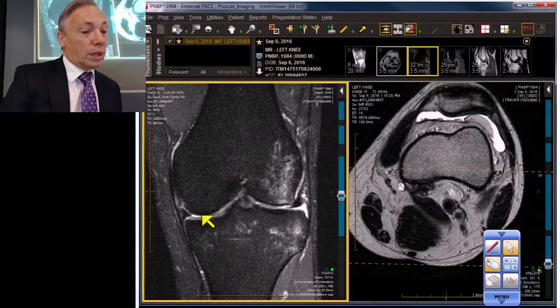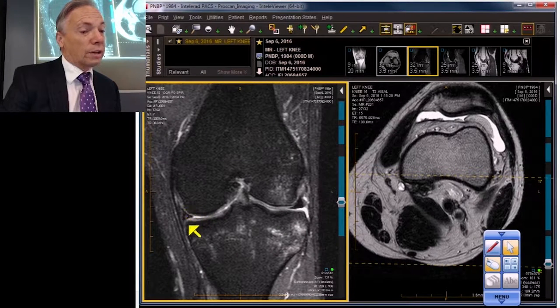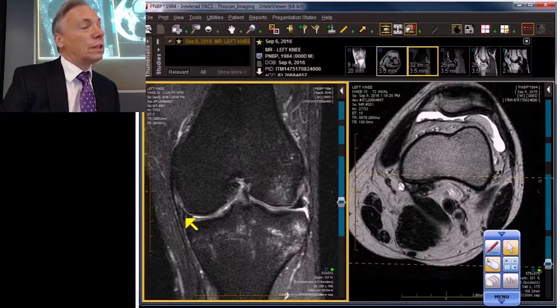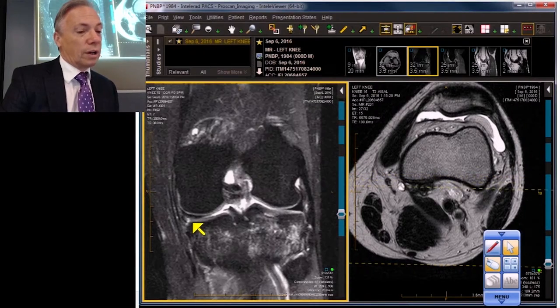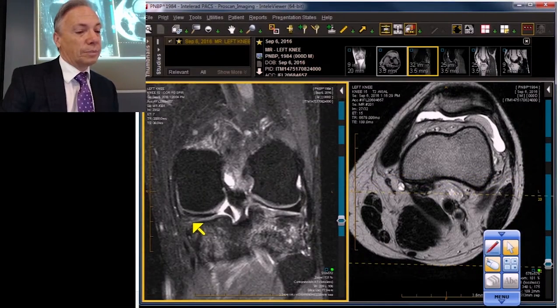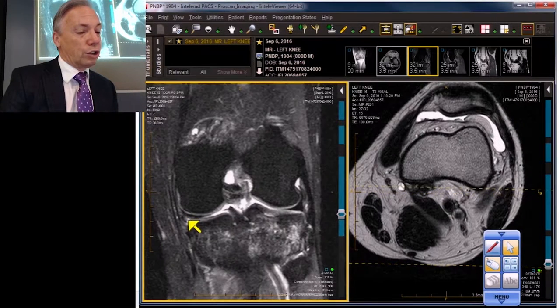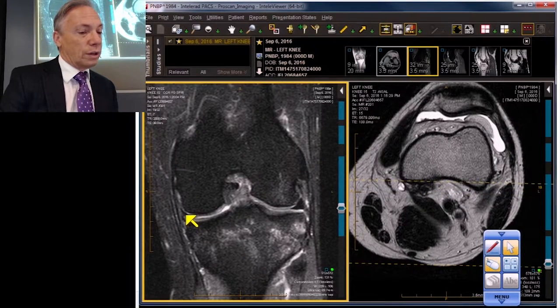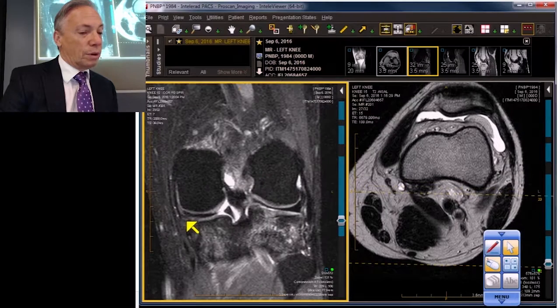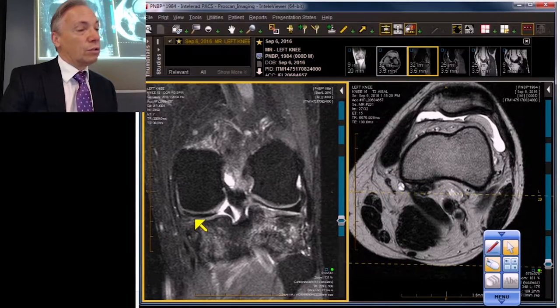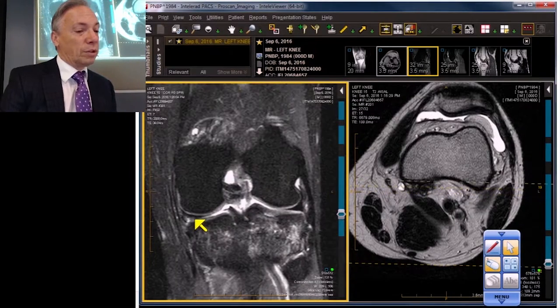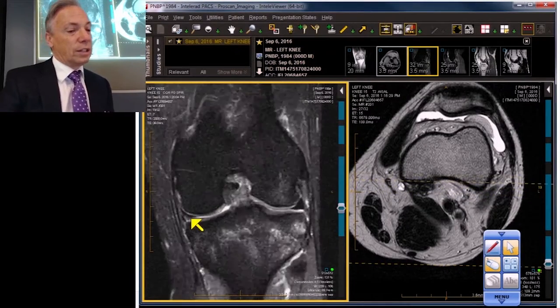You should be dialed into the small character of the medial meniscus. It's got a little vertical signal in it, which is part of our tear. We can follow it into the posterior horn body junction region, so there is a vertical component. There's also a horizontal or oblique component, so there's some complexity to this tear.